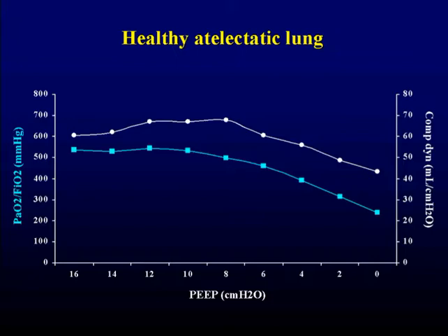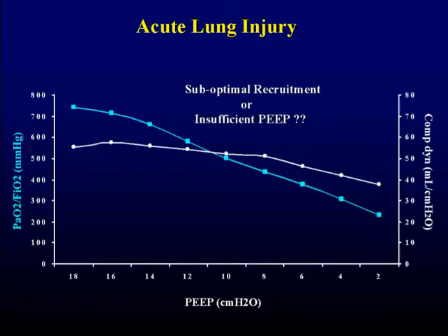Then compared with oxygenation, we showed mostly the same behavior, with an initial increase. These increases probably indicate relief of overdistension as PEEP levels were reduced, getting to a maximum point, and finally reducing the values, also indicating lung collapse. We also were able to identify the individual patterns, and for instance, looking at the pattern of the curves, try to see if we were able to perform a successful recruitment maneuver, or if our PEEP level chosen at the beginning was high enough.